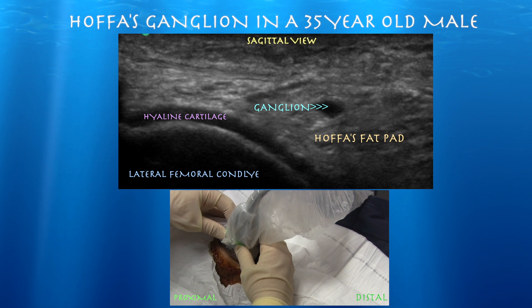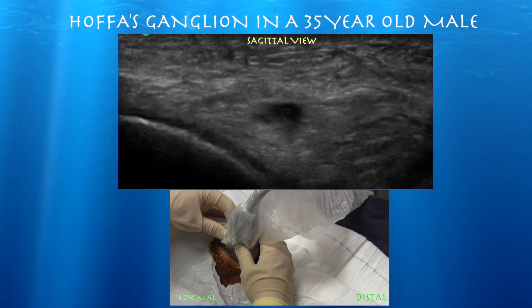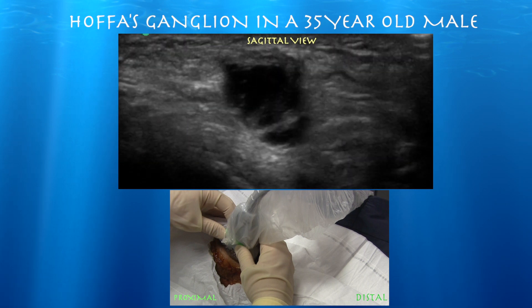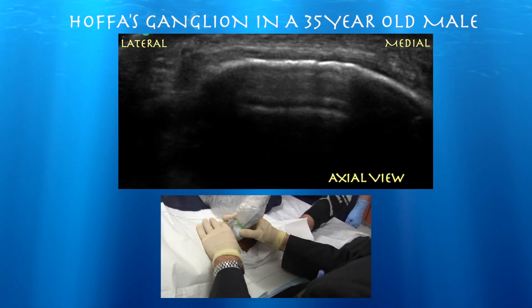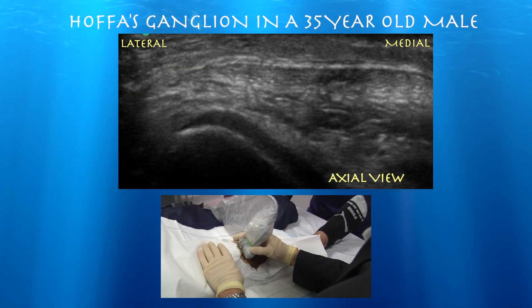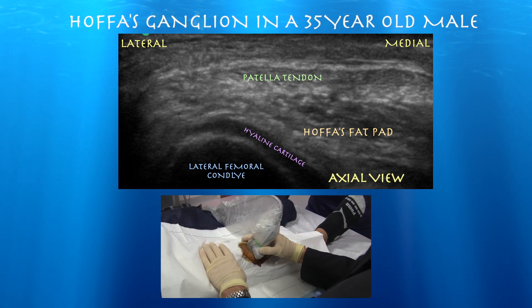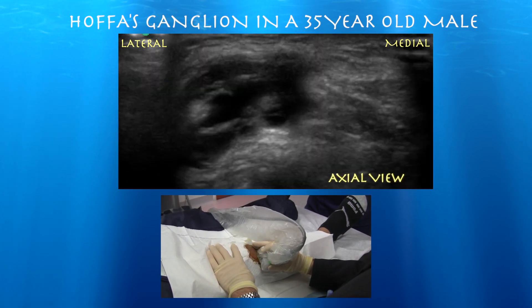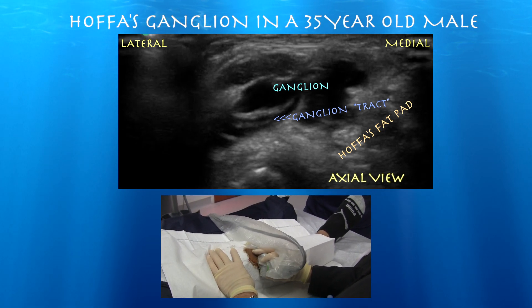Here's a simple sagittal view of his knee. You can clearly see the lateral femoral condyle and a nice wave of hyaline cartilage. And here comes the ganglion as you go more lateral to the patella tendon in the Hoffa's fat pad. You can see a septum within the ganglion itself. Here's an axial view showing a nice, normal-looking patella tendon. And here's the ganglion — quite irregular in the axial plane — and you can see the nice little stalk that I believe communicates with the joint.